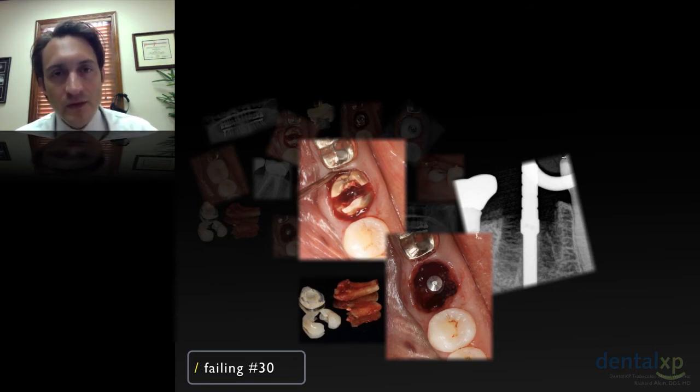I have found, though, even in those cases with minimally invasive surgery and tucking membranes and things like that, we can still provide the solution. Now, you can see here we have the flapless removal of tooth number 30. I'll usually remove the crown. I like it when I can kind of tease the crown off. In this case, I had to cut it, and then I sectioned the roots.